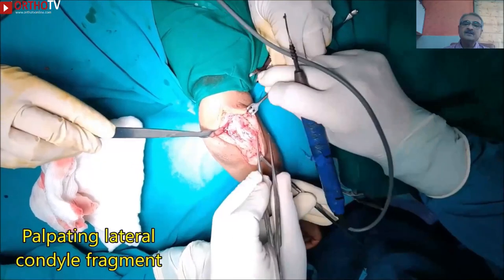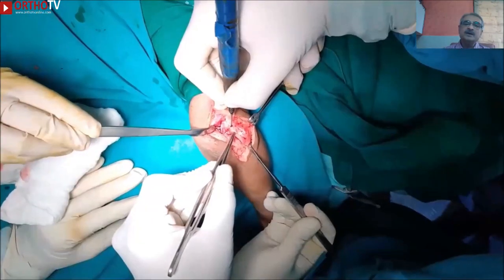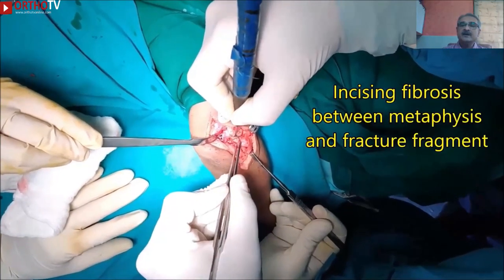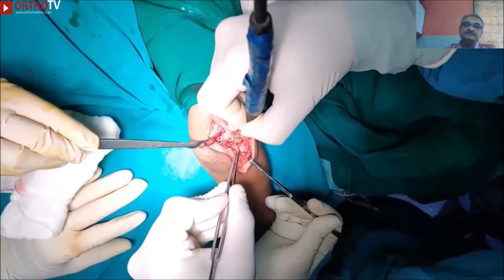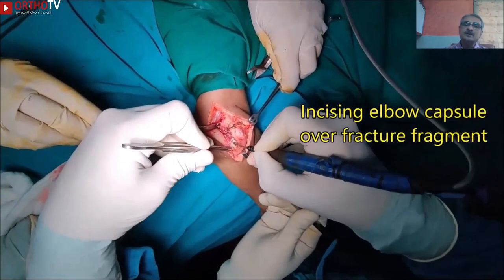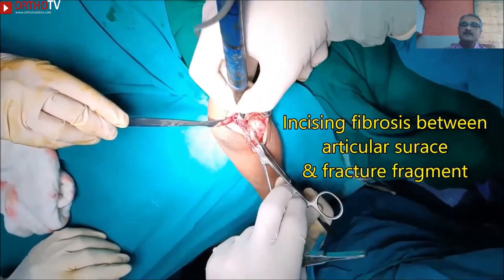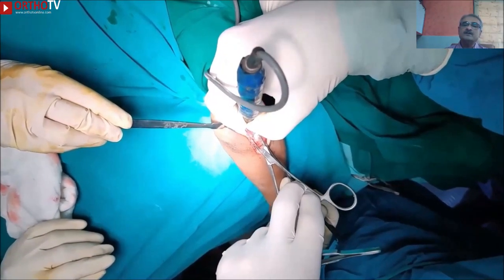Having done that, the next step is to delineate the fracture fragment by palpation. In non-union and late-presenting cases, there may be some fibrosis between the metaphyseal side of the fragment and the fracture fragment, and we start by incising that fibrosis. Once the metaphyseal side is identified, you open the joint capsule over the fracture fragment. Do not disturb any attachment to the lateral condylar fragment. Fibrosis between the articular surface and the lateral condylar fragment should be incised with cautery.